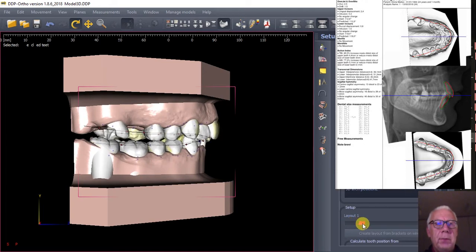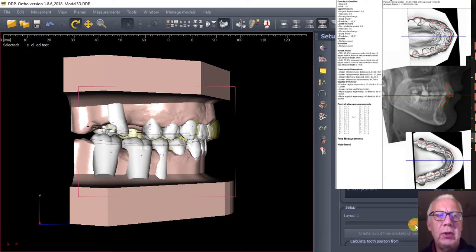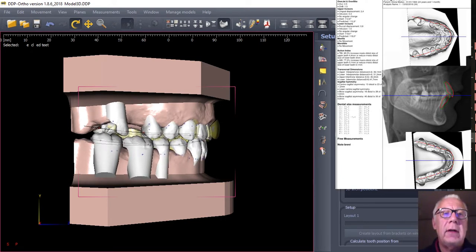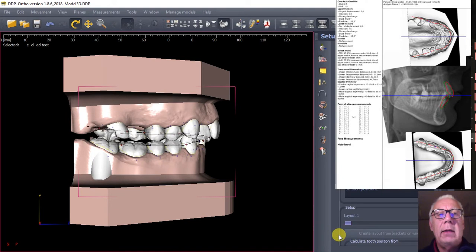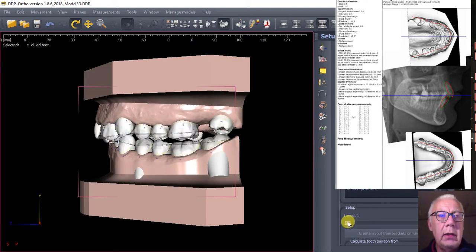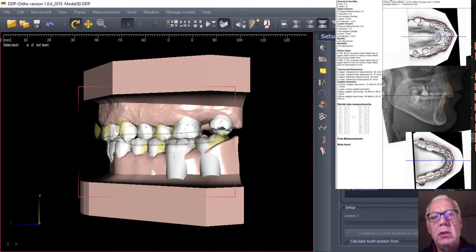This procedure includes the digital occlusion procedure which takes about 10 minutes, where you decide the final position of your front teeth, the size of your dental arch, and the possibility of deciding a symmetry line and decisions about extraction and expansion.